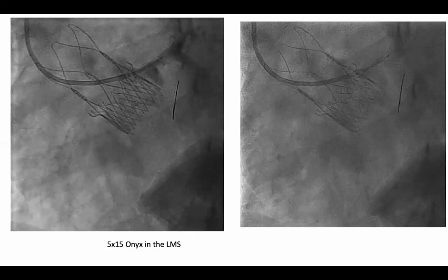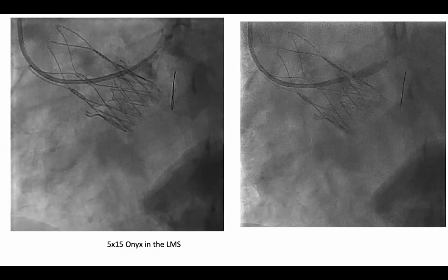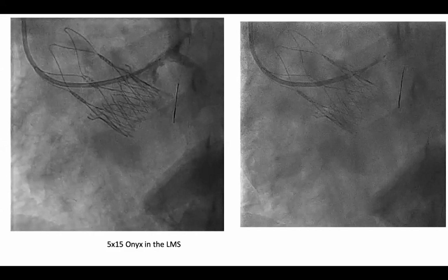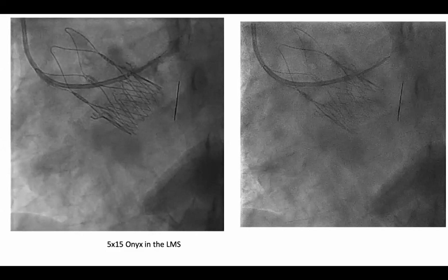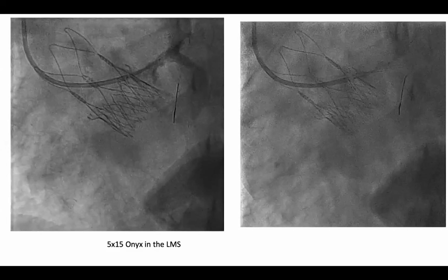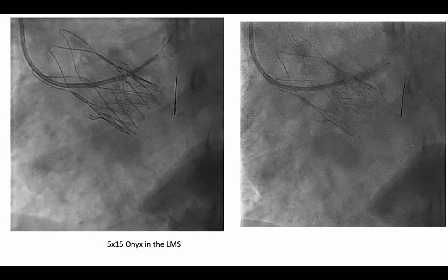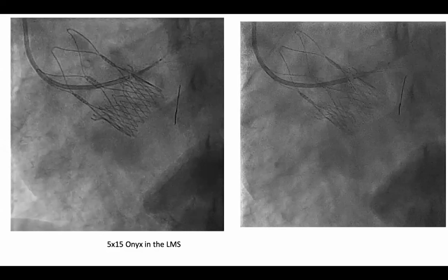I completely agree. The biggest stents that we have, as you know, are about 5 millimeter coronary stents. We discussed this yesterday. We could actually do side-by-side two stents in the left main, but we also discussed that this is not something that we would routinely do. But the idea was, can I chip in here? Sorry to interrupt. Yes.